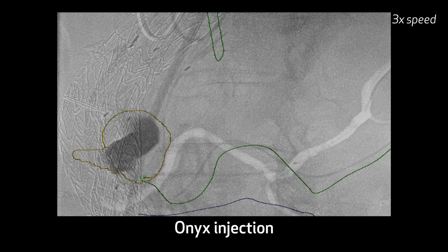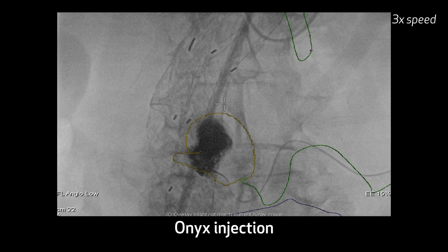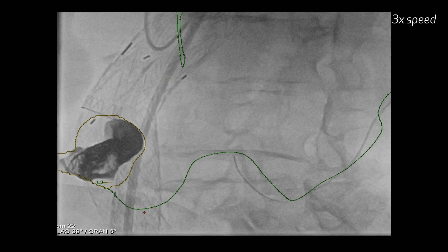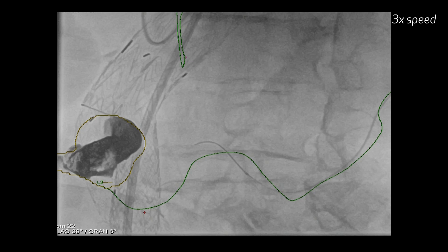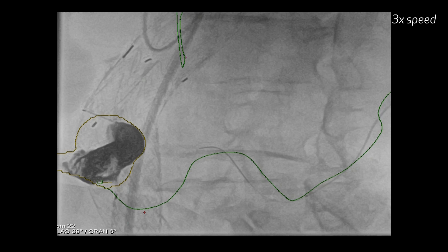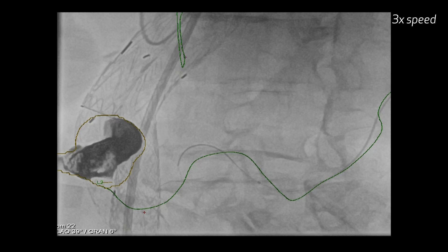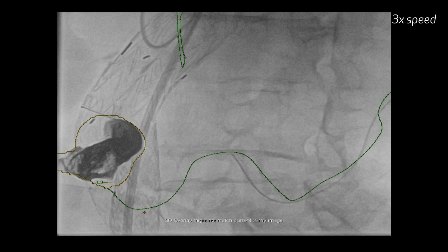Changing the angle — the nice thing about these fusion marks is they move as we change the gantry angle, so it auto-corrects for you any change in gantry angle. What we're trying to do now is optimize so we can see exactly where the origin of that sigmoid branch is. The problem is if you plug up the catheter with ONIX, it's very difficult — you can't really clear it. You have to take it out and get back in there, and that's what happened in this situation because we really wanted to drop in some coils to finish it off.